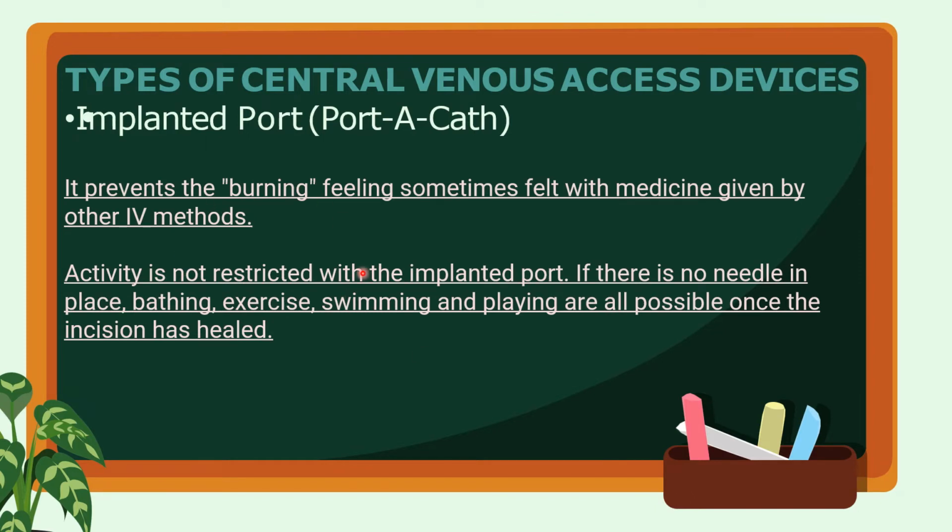Another advantage is that it prevents the burning feeling which is sometimes felt with medicine given by other IV methods. Activity is not restricted with the implanted port. If there is no needle in place, bathing, exercise, swimming, and playing are all possible once the incision has healed.